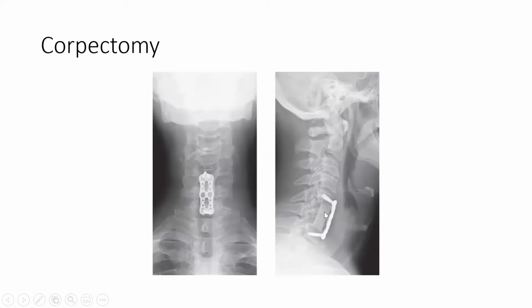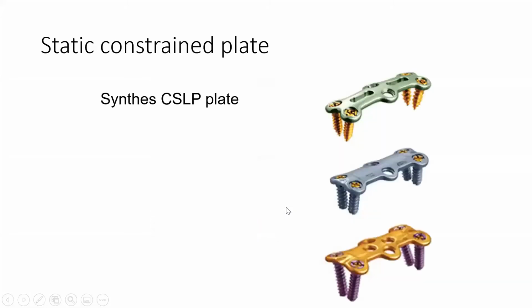And obviously, it's not particularly stable, so you need to span it with a plate, which almost acts like an internal X-fix. You can put expandable cages in here, and that's what we do for tumor probably, but they're very expensive, and this is a nice cheap option. And iliac crest fits very nicely into the cervical spine. It's a nice fit. It's biological. It's got a similar modulus to the bone you're taking out, and that's my preference.